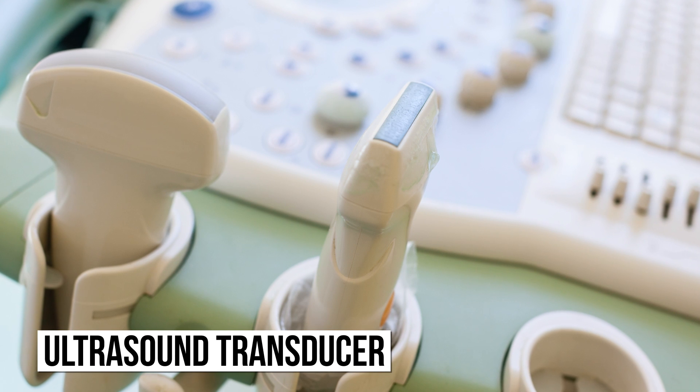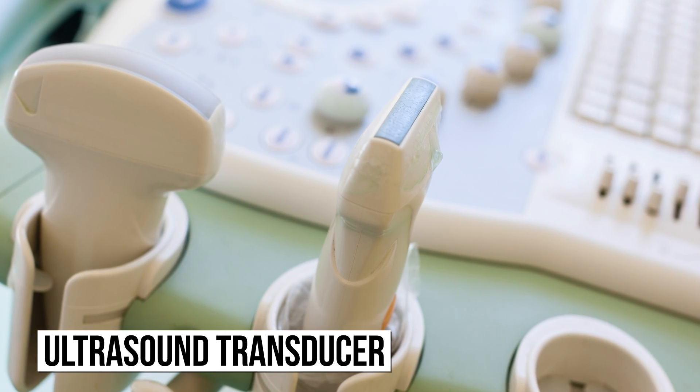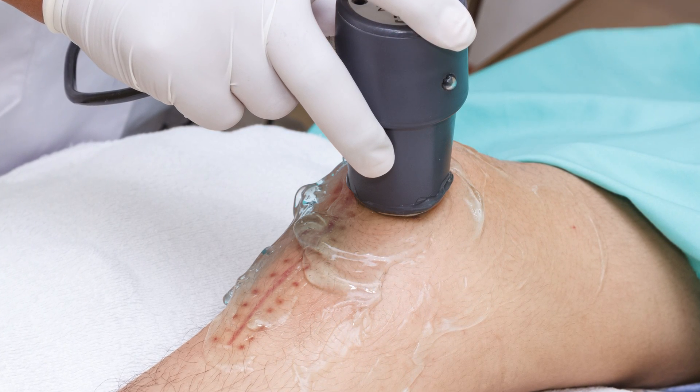Doctors can use an ultrasound transducer to make ultrasound waves that travel through your body and reflect off different squishy bits, like organs or a fetus. Then the transducer uses the reflected waves to create an image. That cold, sticky gel gets smeared on your body to help these waves make it to those inner tissues. But how exactly does it work?